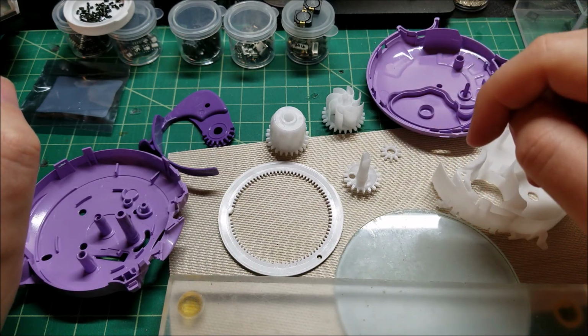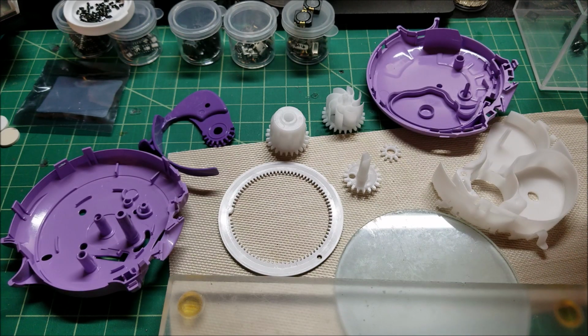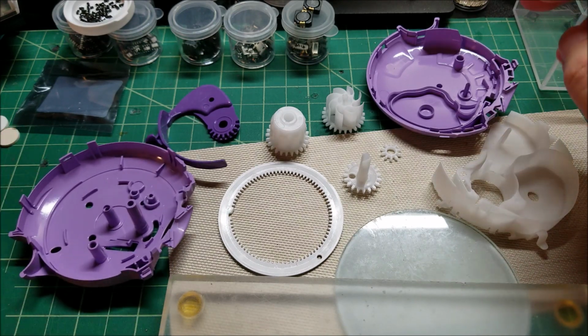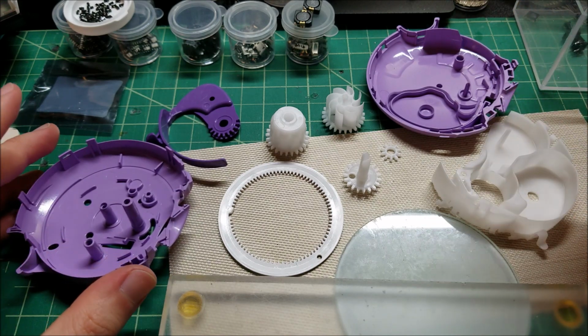With the mechanism, it actually kind of reminds me of an old disposable camera mechanism, the way that they take up the reel of film. So I'm sure this was inspired partially by the simple mechanical mechanism in order to advance a reel of, in this case, medication as opposed to film.